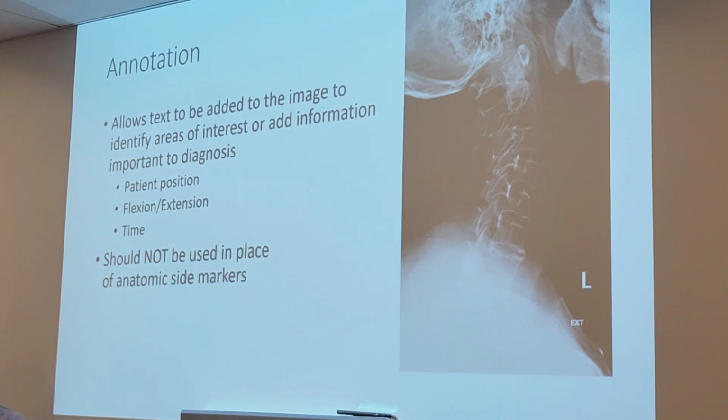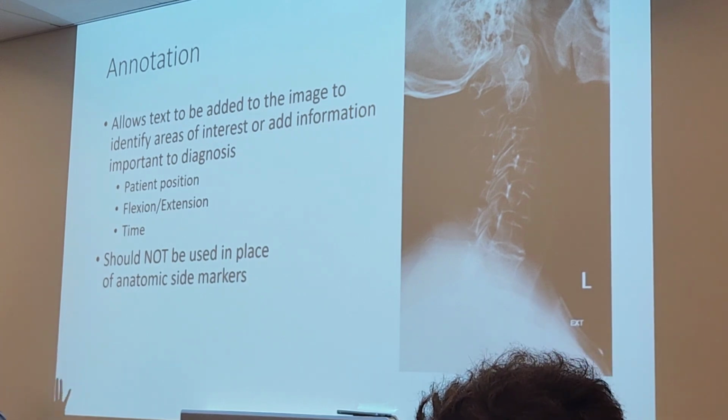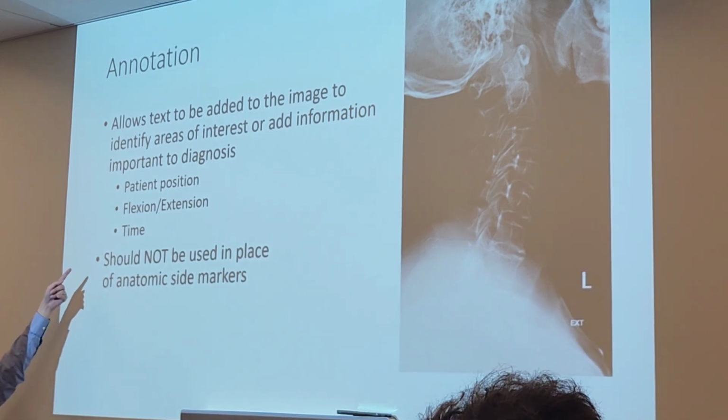Sometimes that patient is there for 2.5 hours and you're like, when is this contrast finally going to hit the ileum? It's stuck in the jejunum for like 2 hours. So, small bowel follow through: you need to mark when you shot the image. This is like a 15-minute shot, 30-minute shot, 45-minute shot, 1 hour, 1 hour 15. So, marking your time.